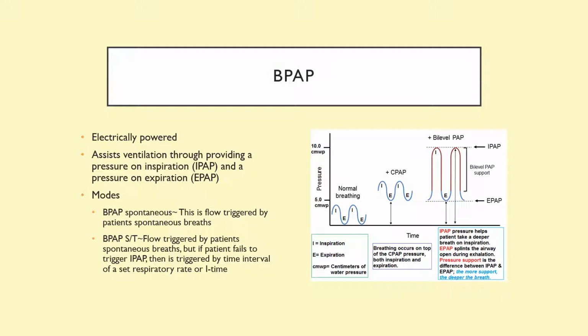We can have BiPAP spontaneous, and this is where the patient takes their own breaths all the time. And then there's BiPAP ST mode, or spontaneous timed mode. This is where the patient can take breaths on their own spontaneously if they want, but if they fail to take a breath, then the IPAP is delivered, forcing a breath to be taken.